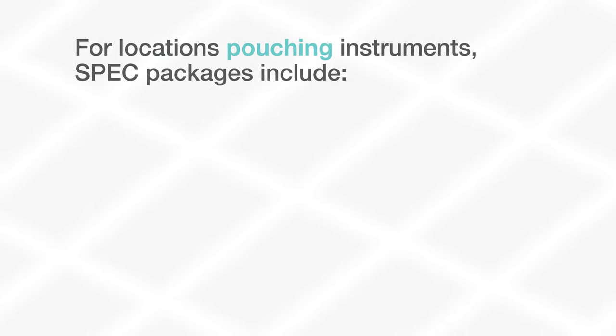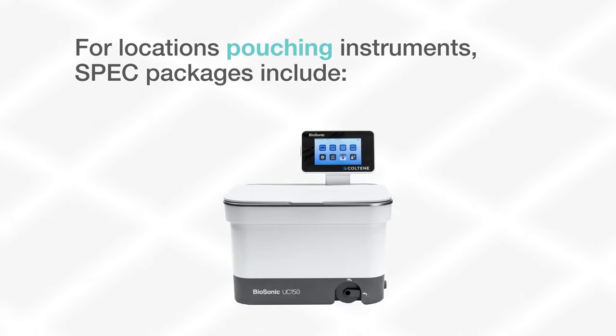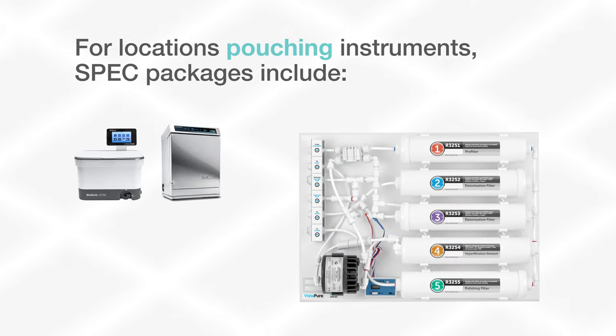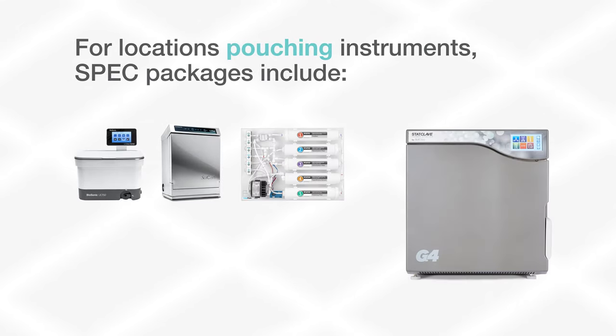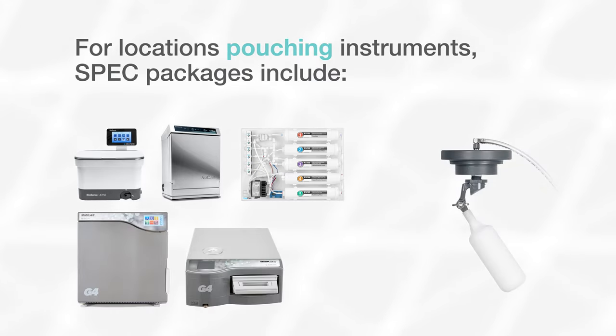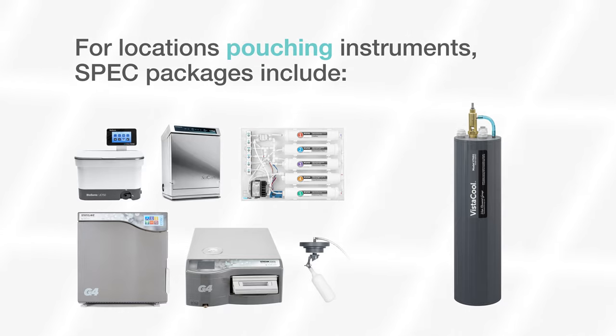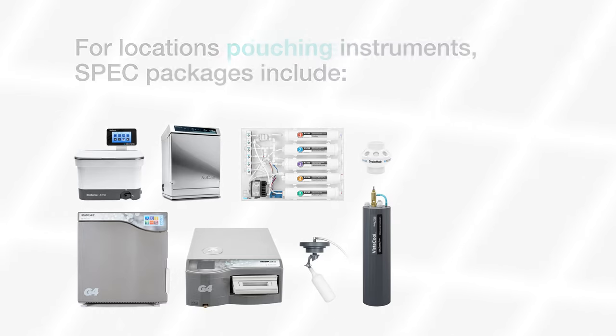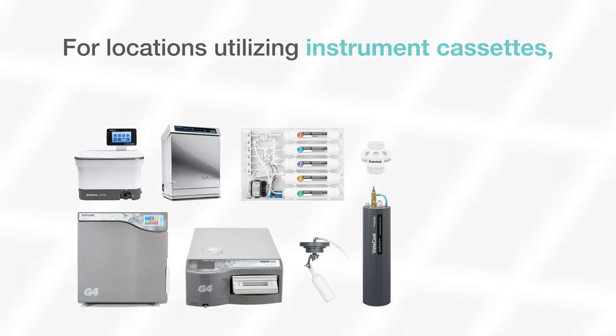For locations pouching instruments, SPEC packages include a Biosonic Ultrasonic cleaning system, Statmatic maintenance unit, Vistapure system, one or two StatClave G4 chamber autoclaves, a Statim G4 cassette autoclave with autofill accessory, Vistacool direct-to-drain cooling system for autoclave wastewater, and connection accessory kits to make installation a breeze.